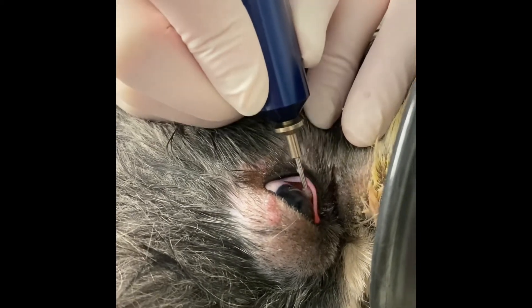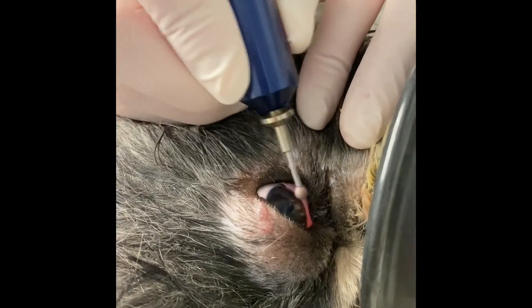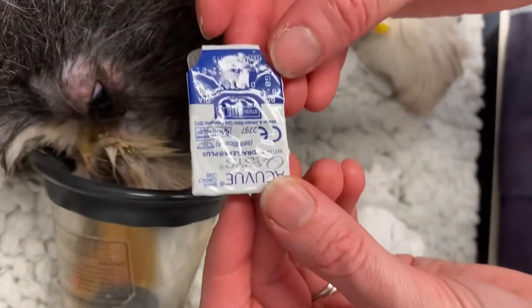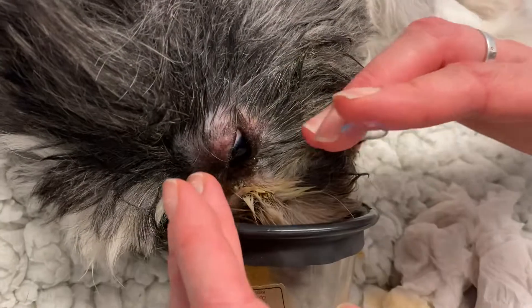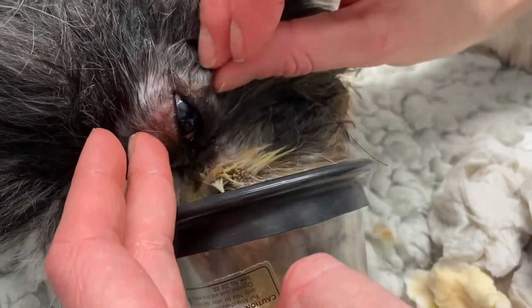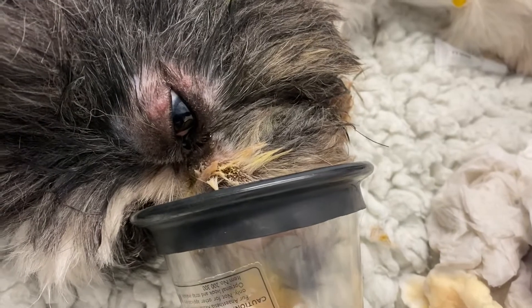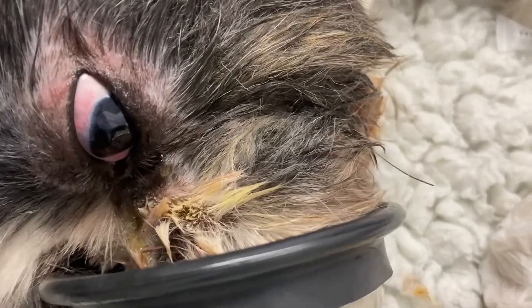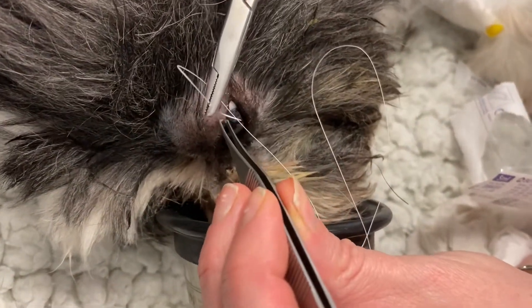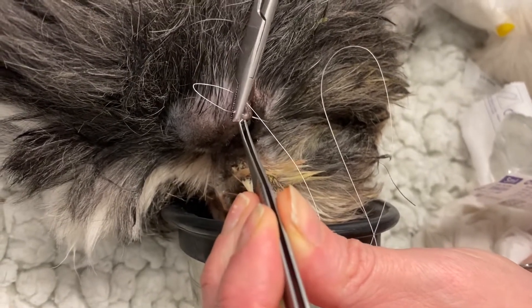Following treatment, my patients will go home on topical antibiotics such as chloramphenicol, lubrication, and some anti-melt medication such as serum or acetylcysteine, as well as often placing a contact lens on the corneal surface. Studies have shown that there are improved results when a contact lens is put in place, along with adequate pain relief, such as meloxicam and maybe a drop of atropine topically as well.